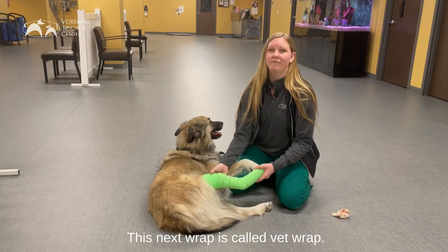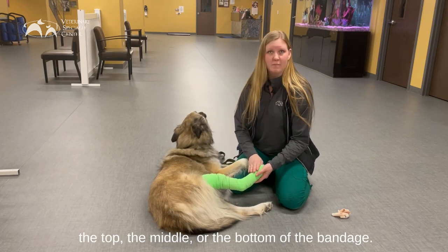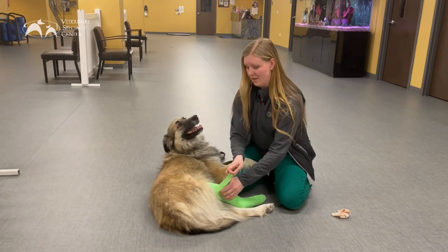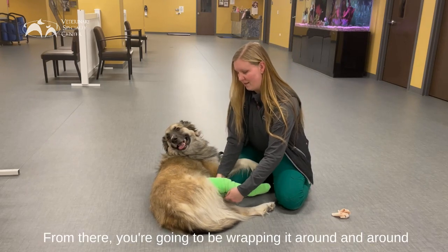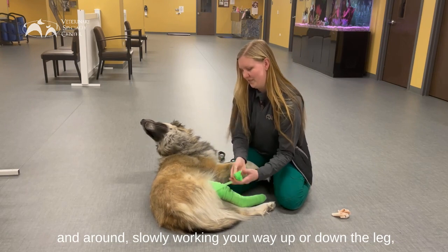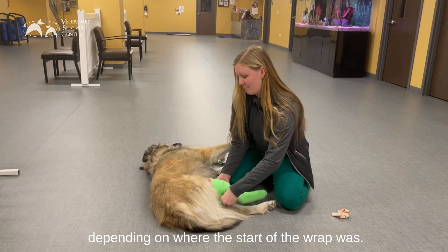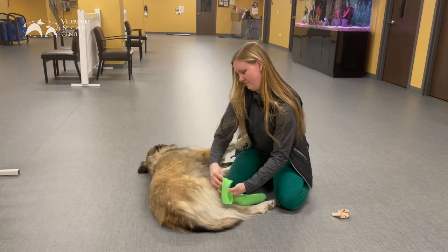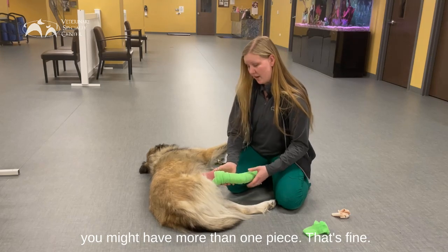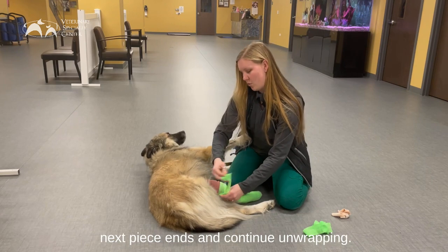This next wrap is called vet wrap. This is going to have an end somewhere either at the top, the middle, or the bottom of the bandage, depending on how it was placed. You'll find an end somewhere that should be able to peel off. From there you're going to be wrapping it around and around, slowly working your way up or down the leg depending on where the start of the wrap was. Depending on the length of the leg you might have more than one piece — that's fine. You'll also have to find where the next piece ends and continue unwrapping.